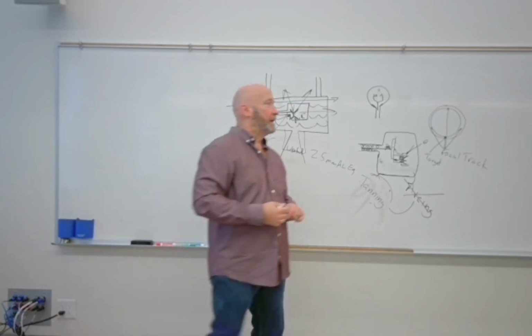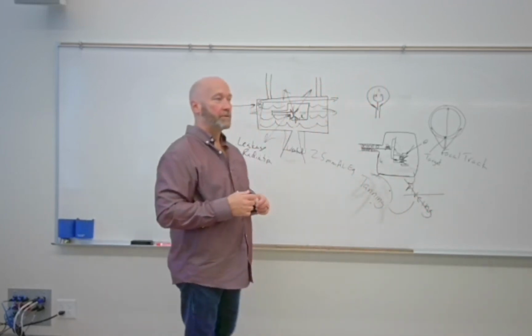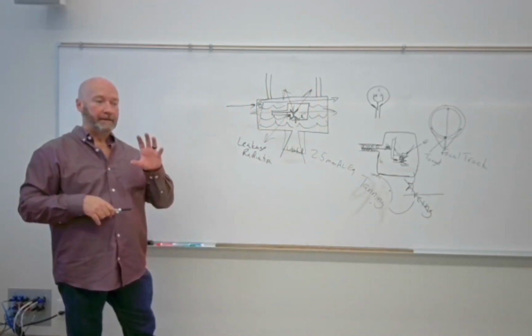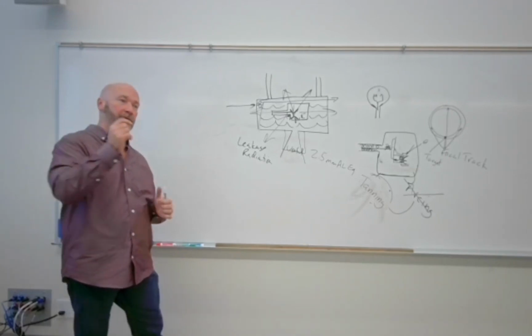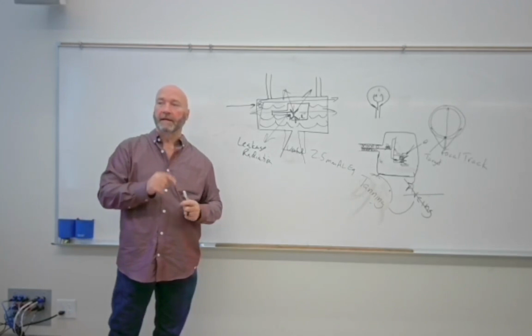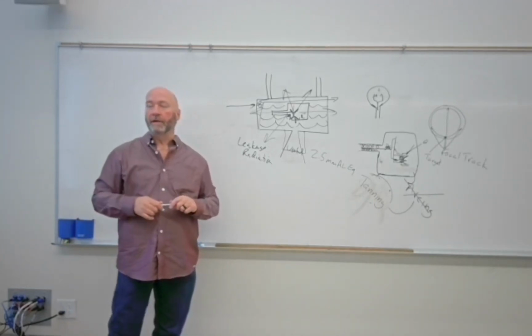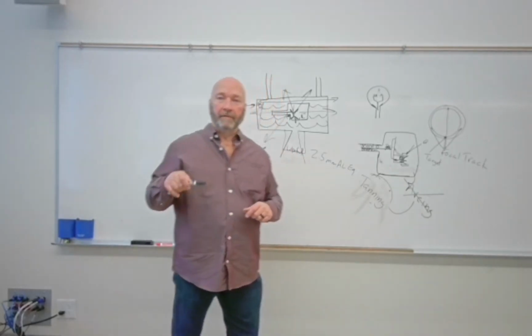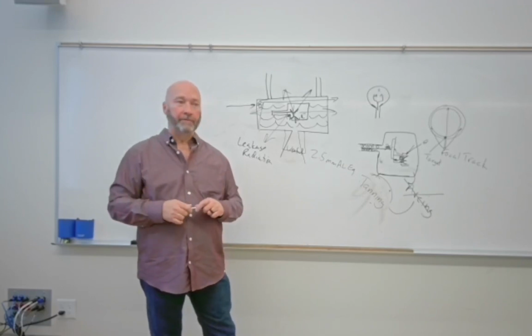The answer is yeah. So we're going to use tungsten because it's got a large nucleus, but also with that large nucleus, what are the binding energies of the inner shell electrons? The closer you get your electrons to the nucleus of the atom, what happens with binding energy? It increases, right? So the inner shell binding energy of a tungsten atom is 69.5 keV.